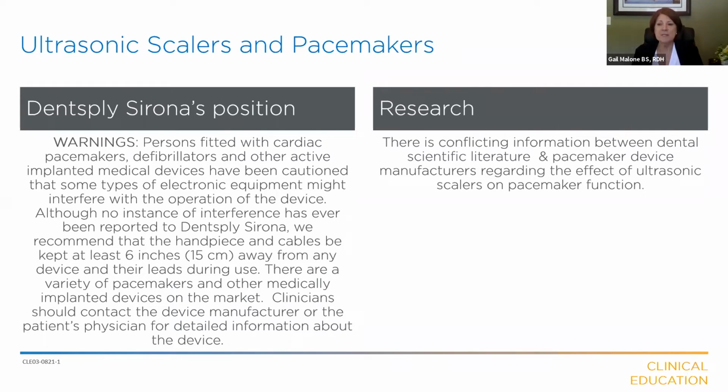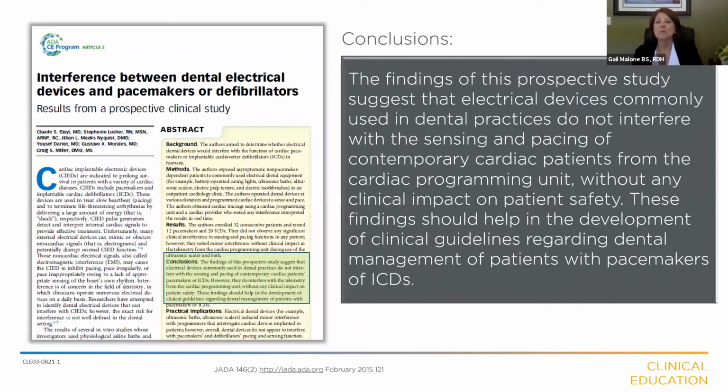There are a variety of pacemakers and other medically implanted devices on the market, and clinicians should contact the device manufacturer or the patient's physician for detailed information about that specific device. Now, we defer to your institutional and national guidance and policies on this topic, but I share with you, as a point of interest, some of the studies that have been published on this topic.